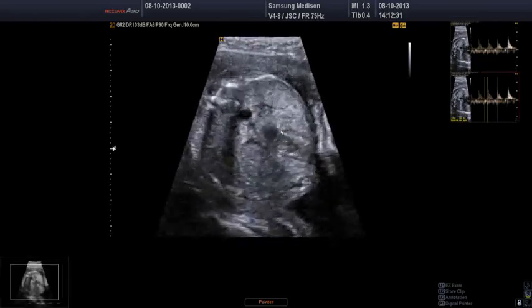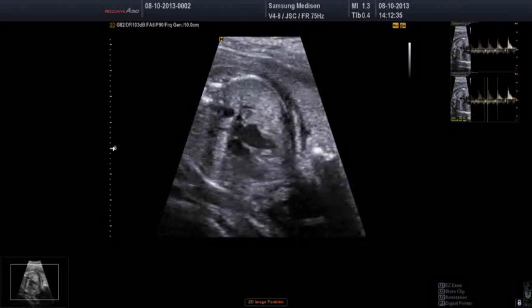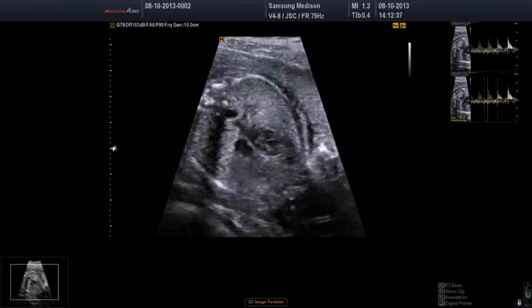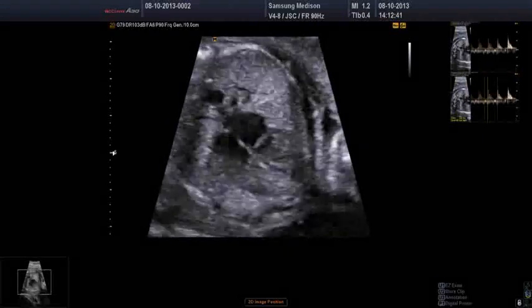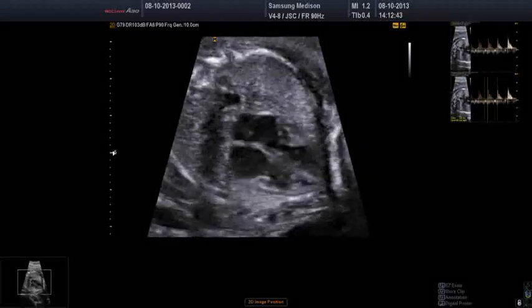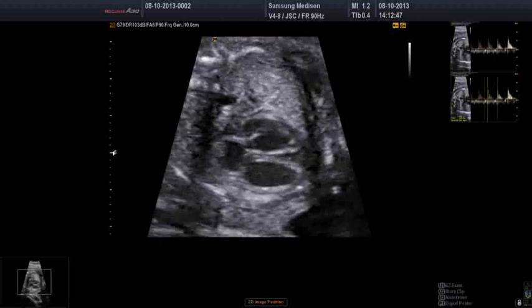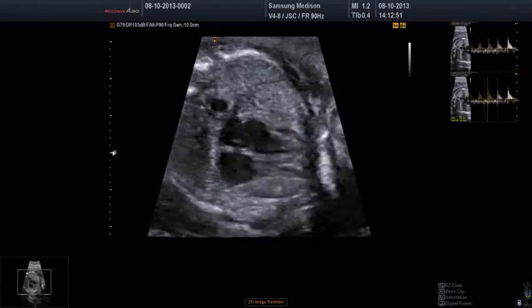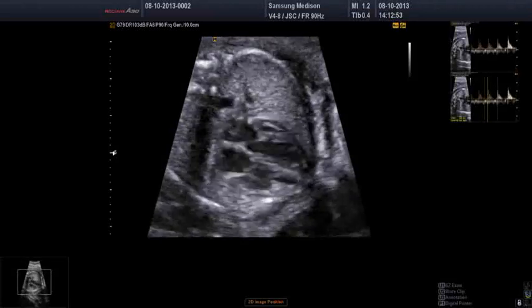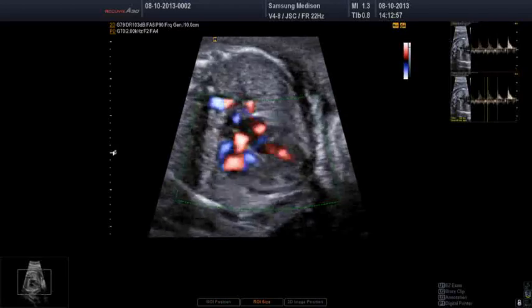You can see, take that arrow away, you can still see all the details, not only the left heart. Yeah, so you can see that flap valve beautifully there. See the foramen ovale, you see the offset, the mitral valve opening and closing. It's just going to move. So it's quite a nice view as well to show you the septum, the septo-aortic continuity.